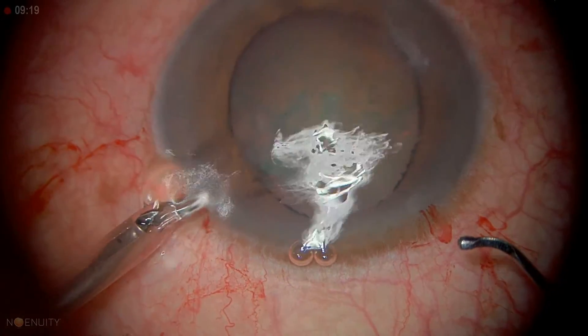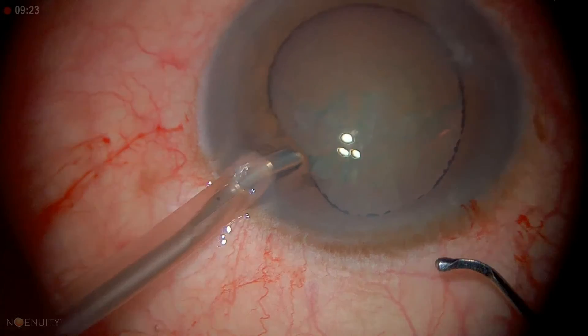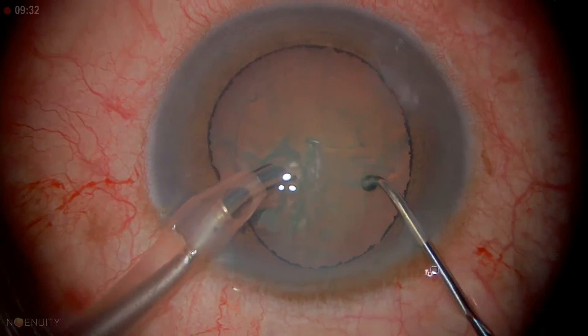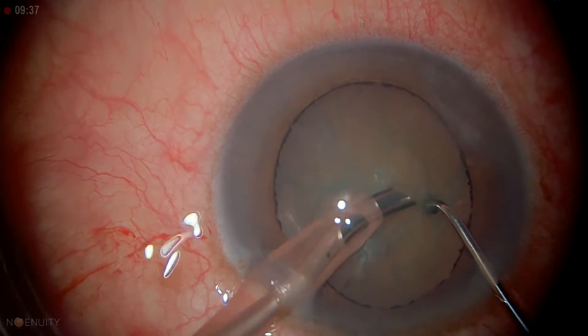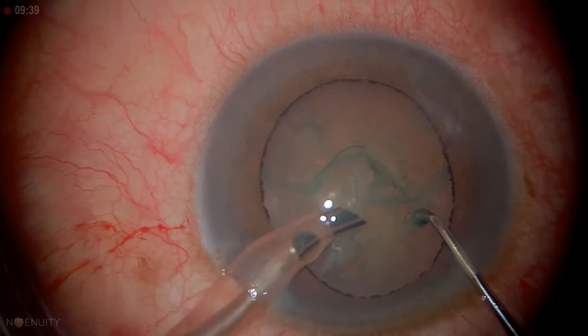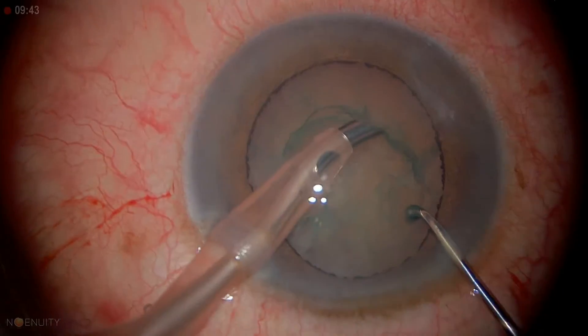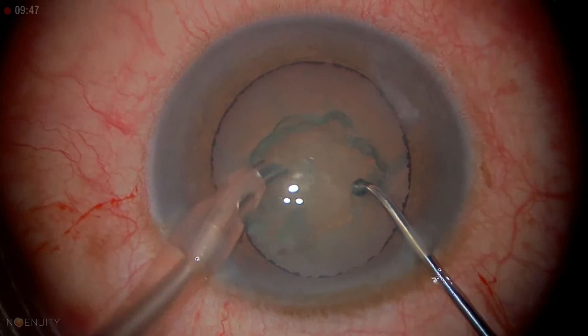We're going to go inside here. There's a pre-chop setting — this is just to get rid of some of the viscoelastic and some of the cortex on the surface, just within the capsulorrhexis, to make it easier to perform your surgery. That's what we're doing here.